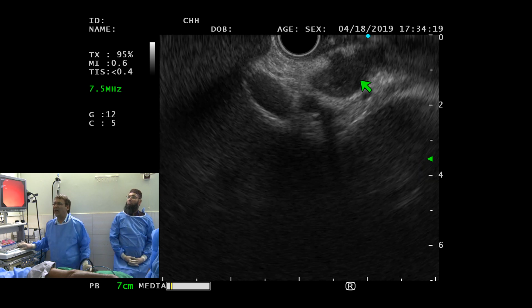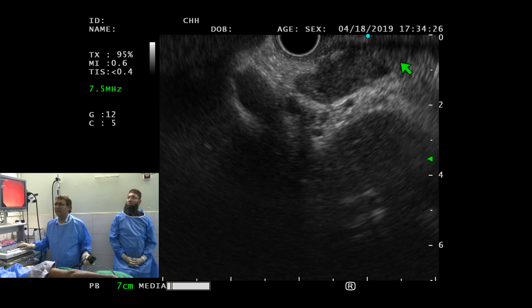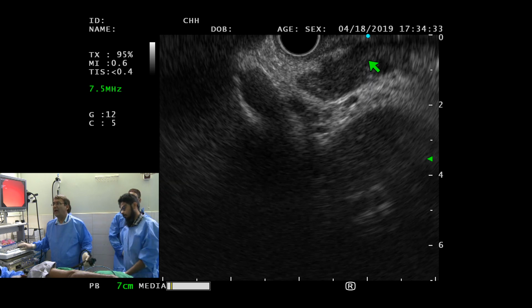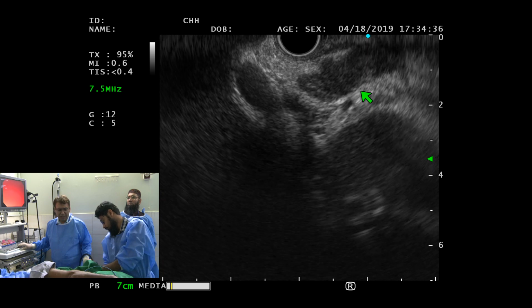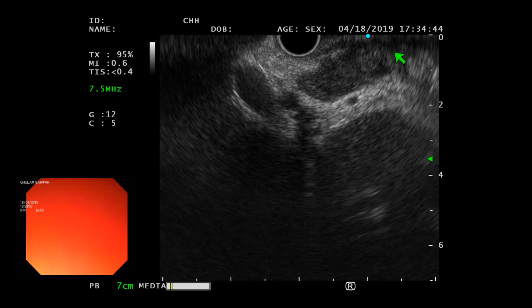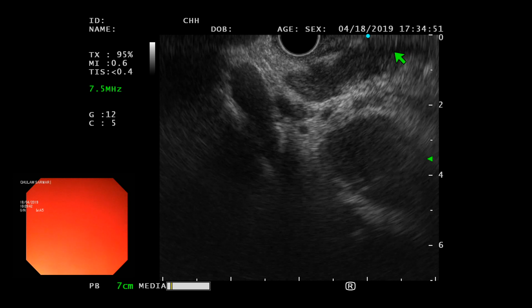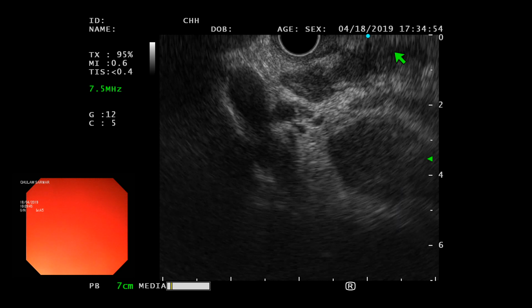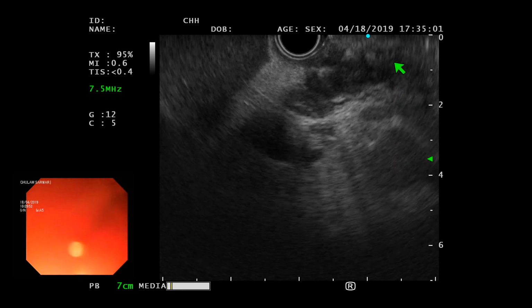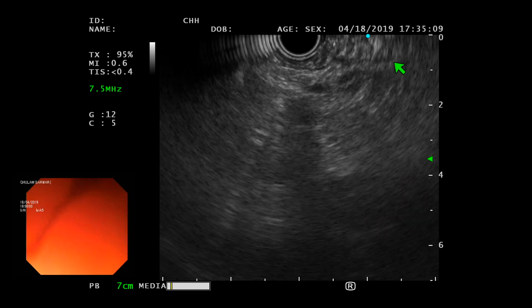But a lot of stuff in the gallbladder. There's a huge stone, and I don't know if it's organized sludge there, like some tissue coming into the gallbladder. Earlier, a point was well made that there was no connection between that sludge ball or tissue, whatever that was, and the wall of the gallbladder, and I agree with that. But I think that tissue, if that really is a tissue, is coming from the neck and going into the gallbladder. Okay? Right there, you see that? Okay. So I think we're going to go ahead and finish this case.